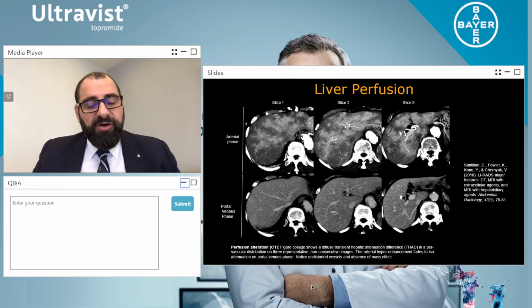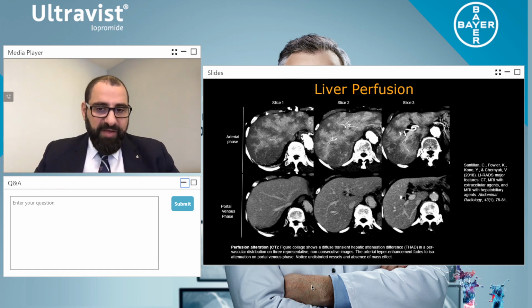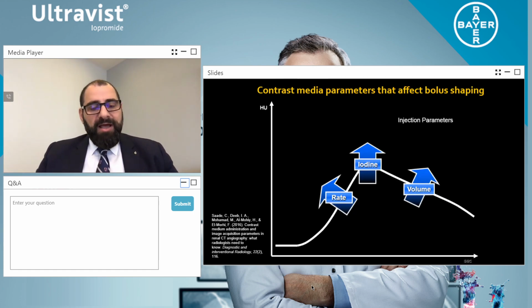So now let's talk about the summary of contrast media delivery in liver imaging. Remember, we talked about injection flow rate, and the faster you put your contrast in there, the faster it's going to go. But you have to remember one key factor here. The most important thing when we're looking at contrast media delivery, the heart can only accept so much blood and actually pump so much blood out.